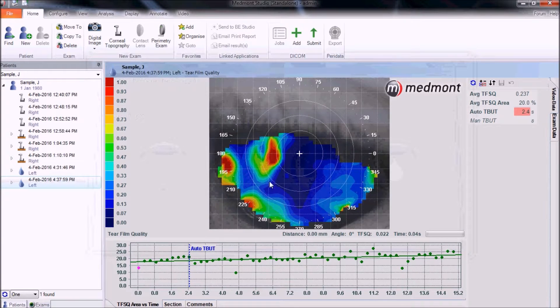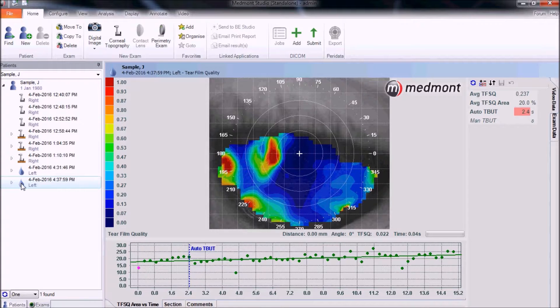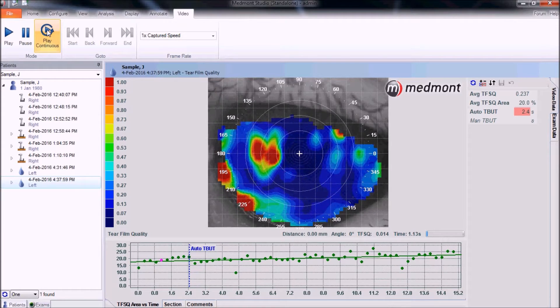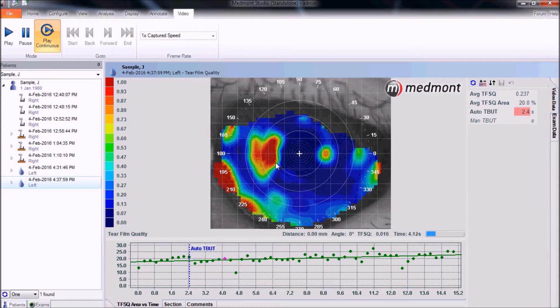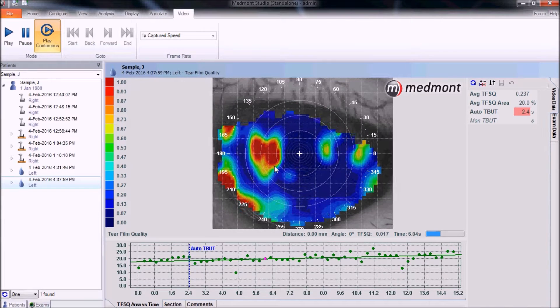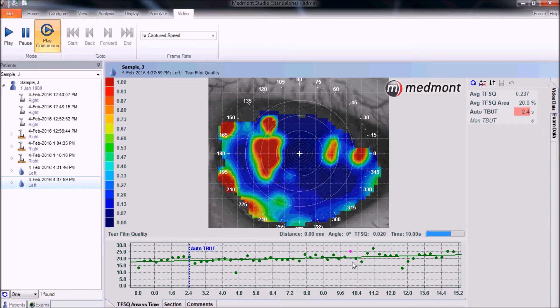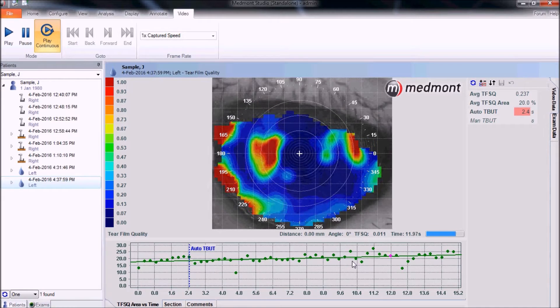If we close the capture window and go to the patient file, you'll note a teardrop icon indicating the tear film analysis video. Go to the video tab and select Play as a Continuous Loop. This allows you to appreciate the tear film over time across each of those images, with the pink dot corresponding to the actual photo taken at that moment.